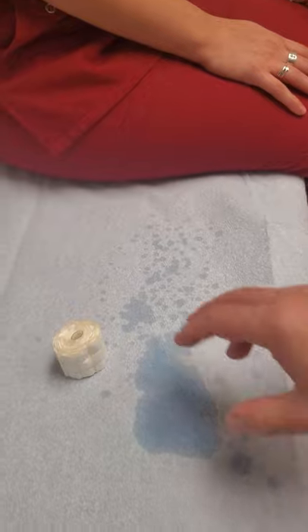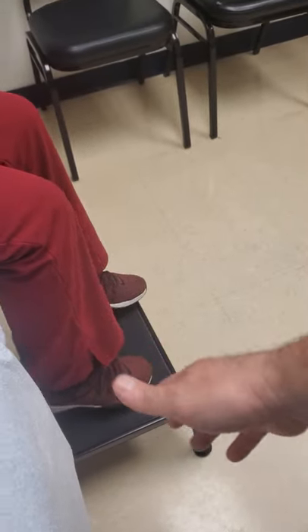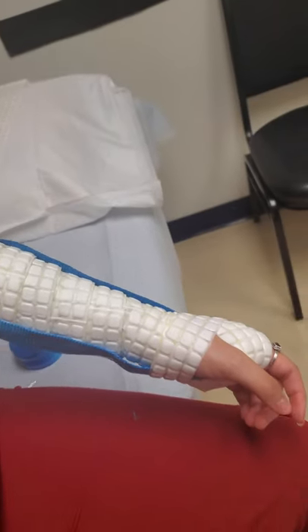Typically we have the patient raise their arm in the shower, rinse it out, then put their arm down inside the tub and shake it for about three to five minutes. If need be, we have them blow cool air through the end with a hairdryer — cool air only — if the shaking doesn't suffice.